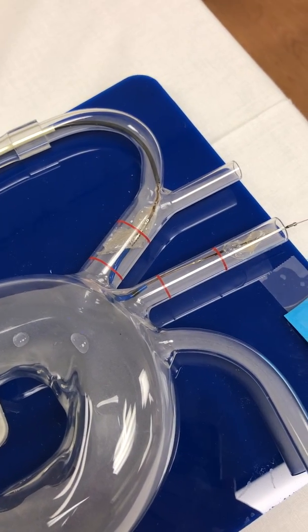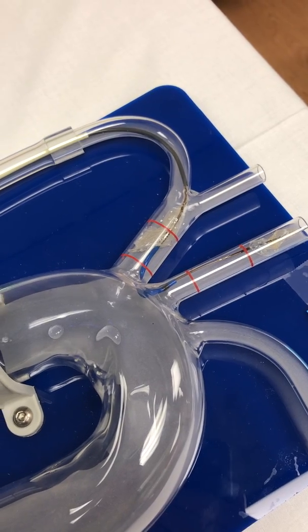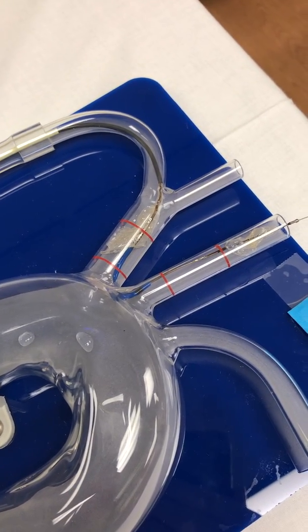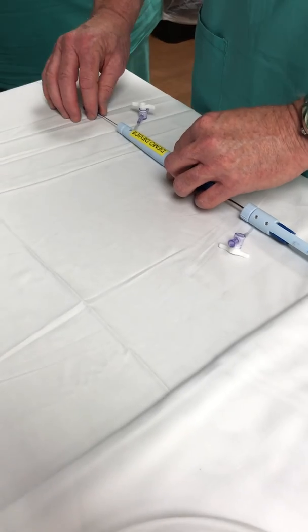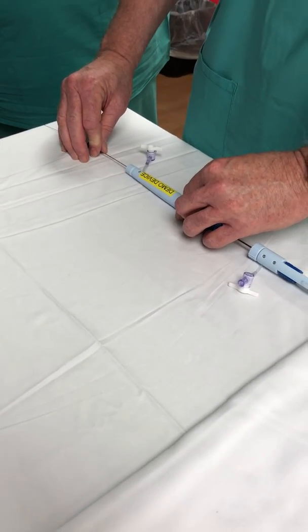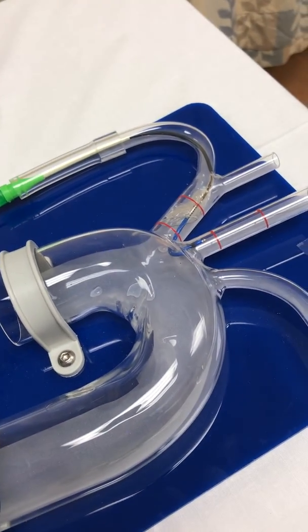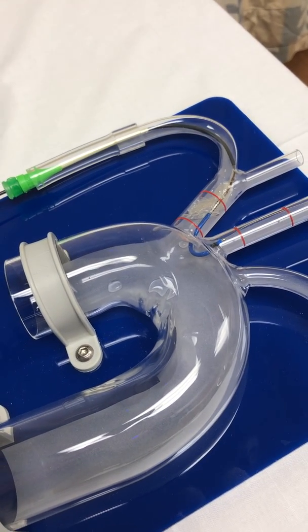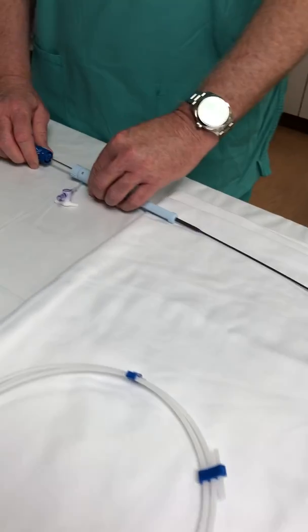Now the procedure is done and we're ready to remove the Sentinel. Our ACT is 250 and we're going to reverse the steps. We go to number three and resheath the distal filter — sliding backwards — and under fluoroscopy you'll see when the metal tip ends. Once fully resheathed, we put the handles together, which drops it back into the aorta, and at the same time we can take the curve out with number two. Once the curve is out, we push the handles all the way together.